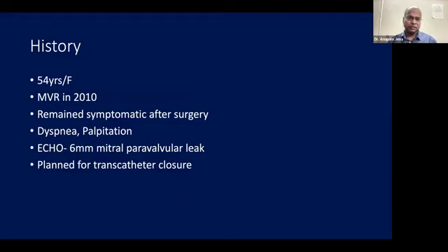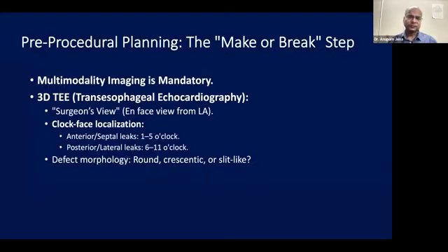A 54-year-old female who underwent MVR in 2010 remained symptomatic after surgery with dyspnea and palpitation. Her paravalvular leak was diagnosed early, but she was taking heart failure medications and going on. Finally she landed up with refractory symptoms, and she was advised transcatheter closure and was referred to me.